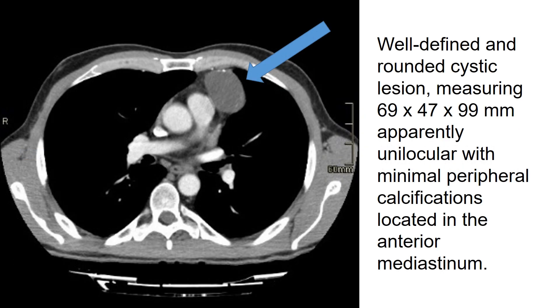In the chest CT, there is a well-defined and rounded cystic lesion, measuring 69 by 47 by 99 millimeters, apparently unilocular with minimal peripheral calcifications, located in the anterior mediastinum.